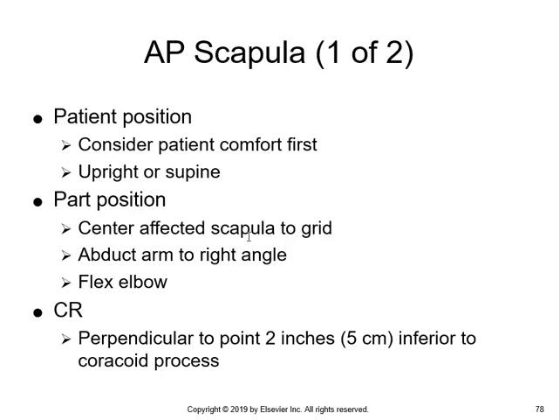One thing I should have pointed out earlier, once we get to the humerus, we start to get to an anatomy thick enough to consider using a grid. Remember, we have two rules for grid use. If we use a KVP that's above 70 KVP or anatomy that's 10 centimeters or above, we really kind of need to use grid.